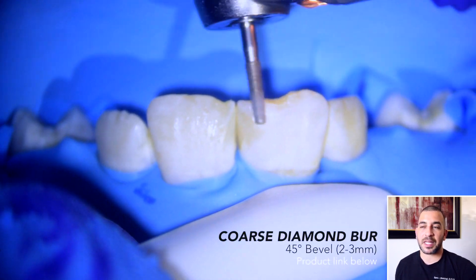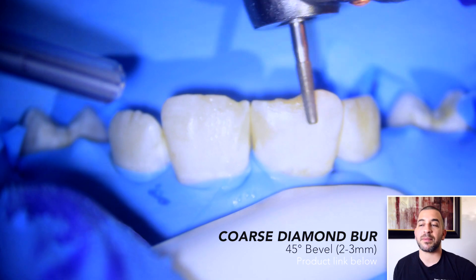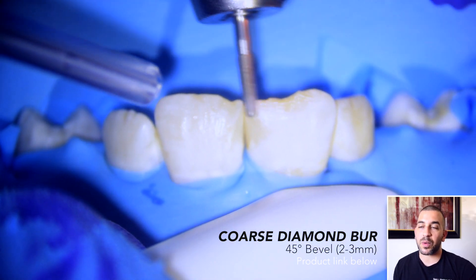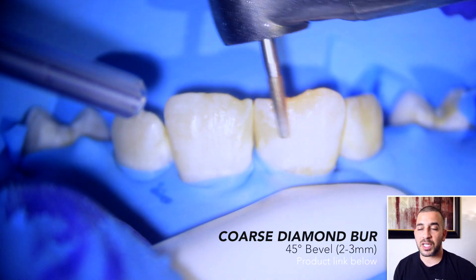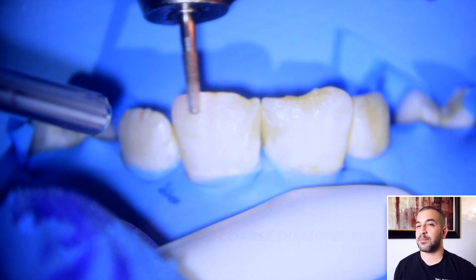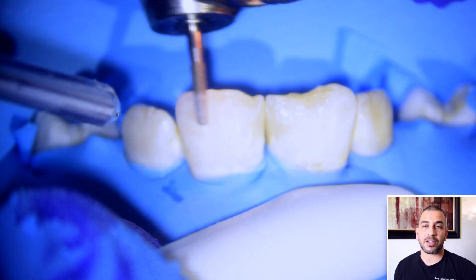Whenever I see this type of presentation with kids, we do the best that we can to be conservative in our treatment. As they get older, possibly when they're 18 or 21, we can consider options to correct for these white spots through composite or porcelain veneers, resin infiltration therapy, or some other means to make his teeth look a little bit more natural. But for today's procedure, I just want to give the front teeth a little bit more shape and characteristic.